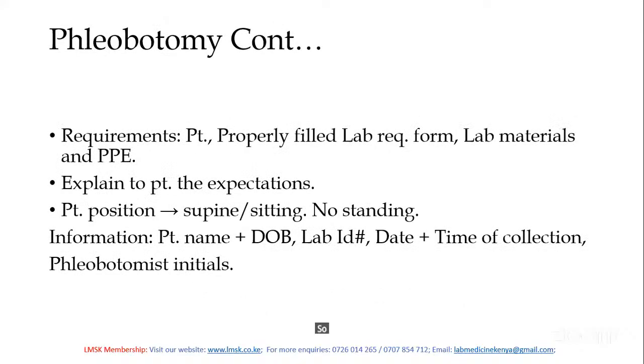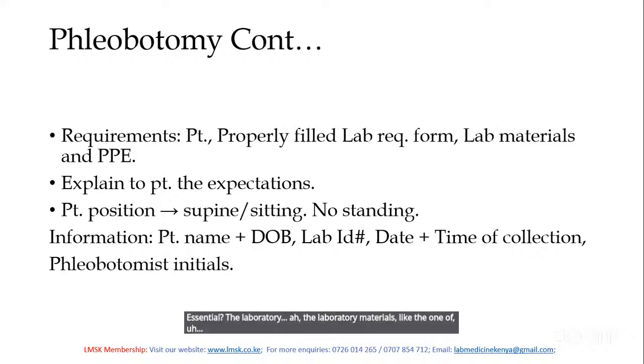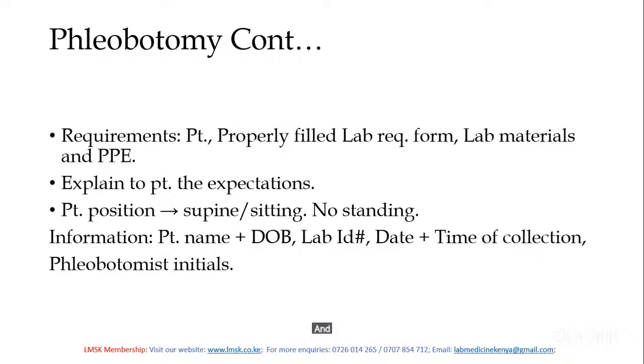So to collect blood, you require, of course, the patient, then a properly filled laboratory request form. It should be properly filled. This is very essential. Other laboratory materials, like the ones I've mentioned earlier, the needles, the tubes, and the PPE. Those are the major requirements for phlebotomy.